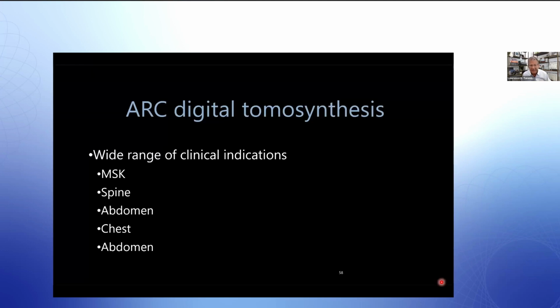So we covered a lot of things today. MSK and spine. Well, look, I typed in abdomen twice because I forgot to put the abdomen in. I guess that's there just to remind me that there are other circumstances where tomosynthesis might be helpful in terms of kidney stones and bladder stones and the like.